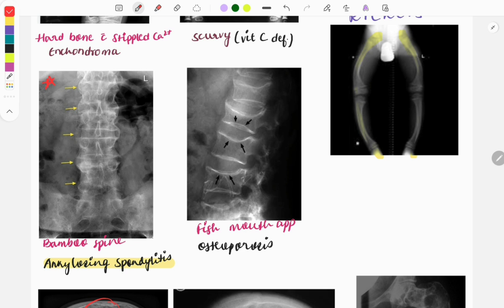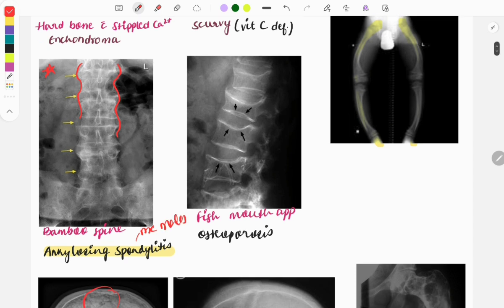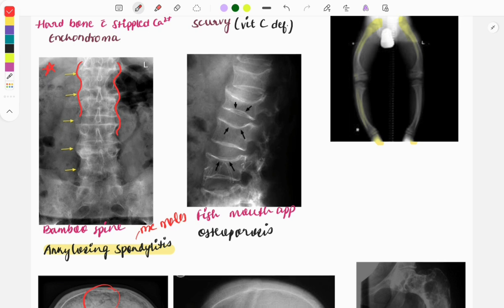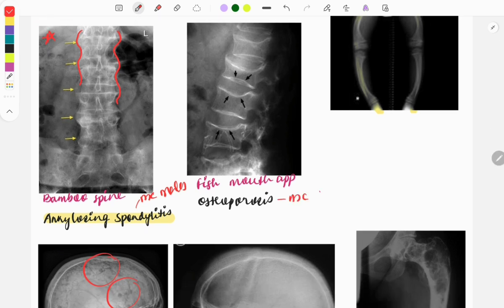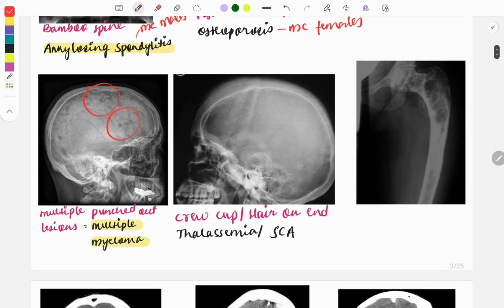The next image is bamboo spine, a very famous finding seen in ankylosing spondylitis. The spines have fused with each other, giving the bamboo spine appearance — a classical finding most commonly seen in males. Moving on, the fish mouth appearance is seen in osteoporosis, most commonly in females, and is due to weak bones.